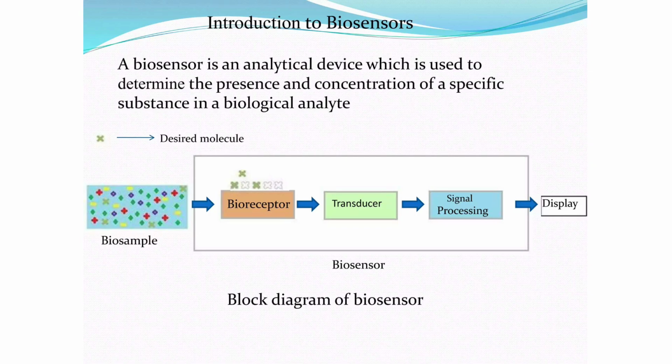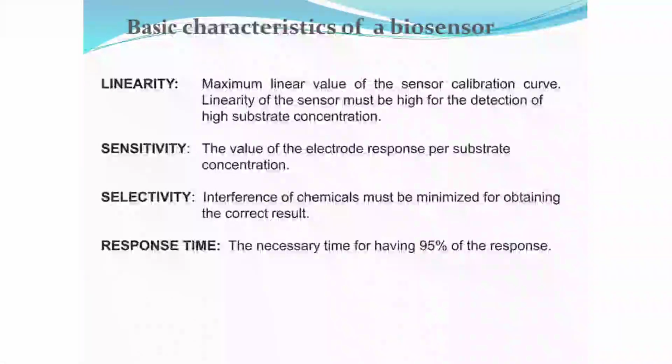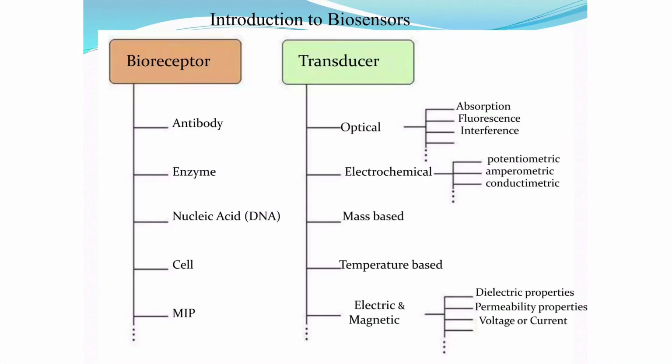And to convert this chemical reaction into an electrical signal, we use amperometric transduction. In an amperometric biosensor, you can see the voltage is applied between the working electrode and the reference electrode. The hydrogen peroxide byproduct diffuses to the working electrode, where it undergoes electrochemical oxidation, and this reaction liberates electrons to generate a small electrical current.